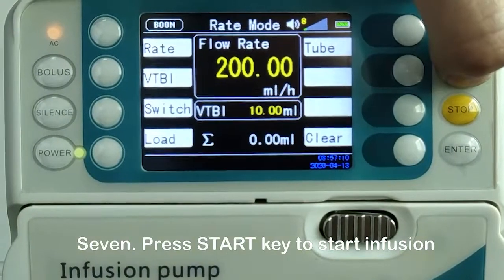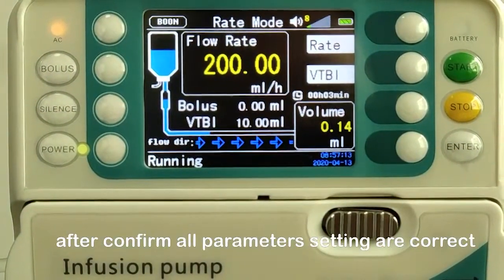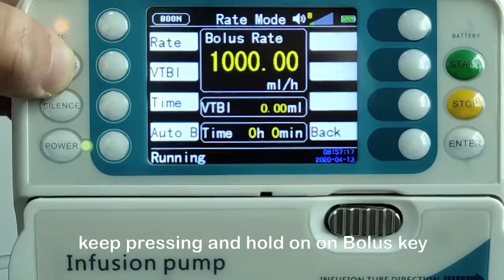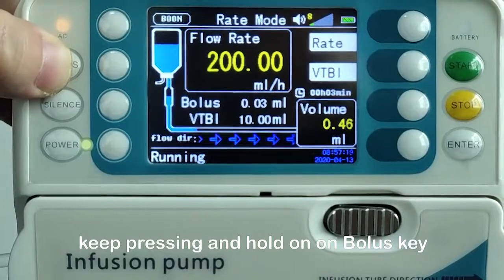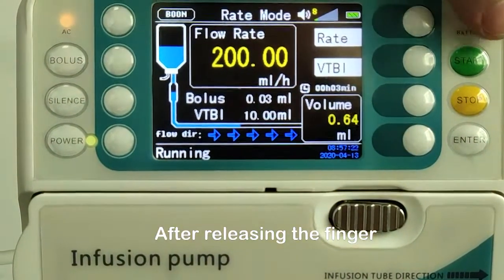Step 7: Press the start key to begin infusion after confirming all parameter settings are correct. If a high flow rate is needed, keep pressing and holding the bolus key. After releasing the finger, the flow rate returns to the original rate.